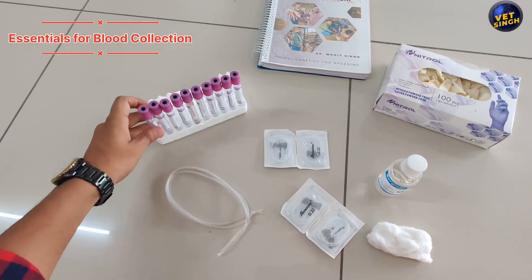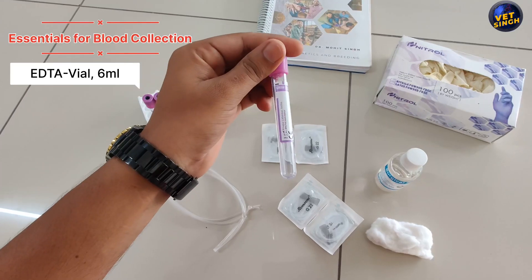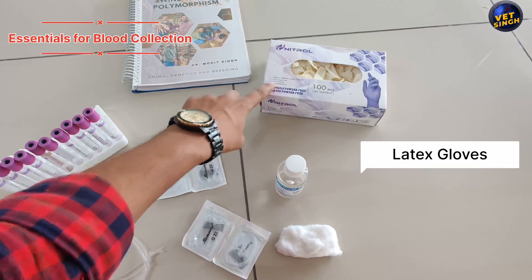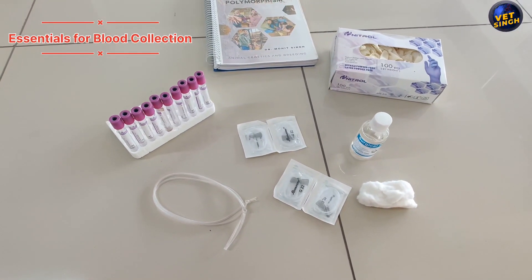For the blood, we need a vial — the total volume of the vial is 6 ml EDTA vial. And at the end, we need latex gloves. So these are the items required for blood collection.